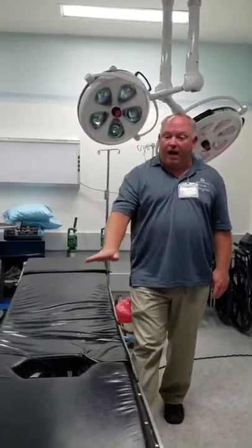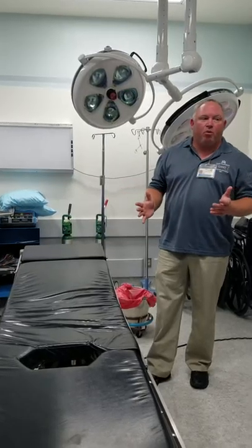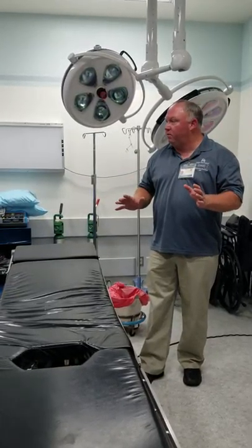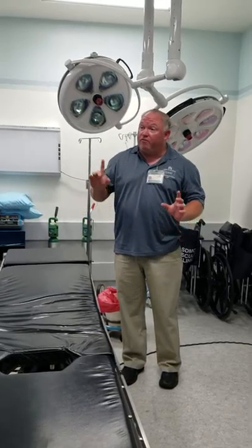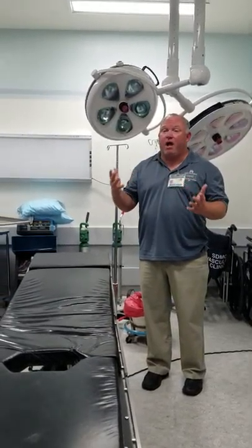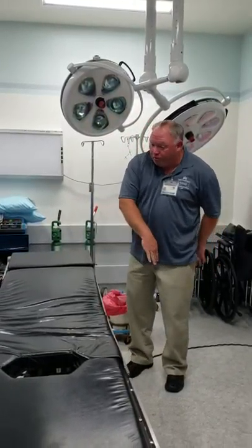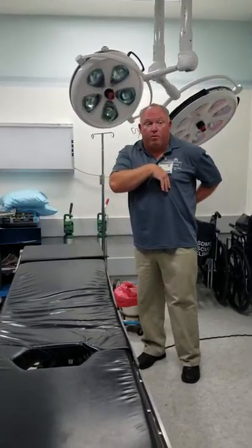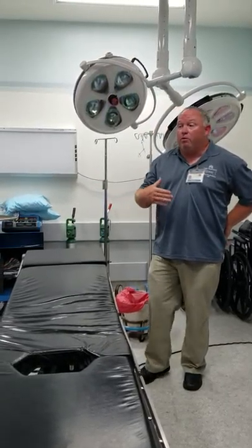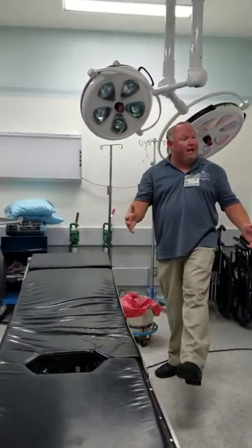They're going to set the patient up. They may want the patient at a certain level of the bed — further down to the feet or further to the head — that would be doctor-specific. The patient's leg will be elevated on a leg holder. We will drape the patient out with what we call a sterile U drape. We're going to drape from the groin, straight up the body toward the nipple, and right below the buttocks. The nurse will prep all the way to that edge — either below the knee or the whole leg, depending on the doctor.